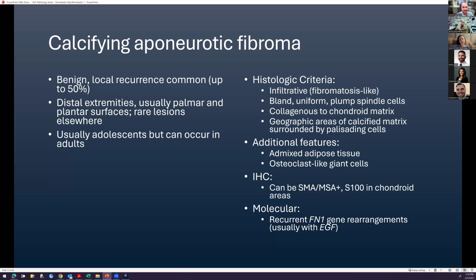Epithelioid sarcoma. Epithelioid sarcoma, okay, right? If you're wondering whether those palisaded epithelioid cells could be surrounding necrosis, with a more granulomatous-like look, you could wonder about epithelioid sarcoma. It's a possibility. Other big things to think about are pseudogout. Fibromatosis, maybe.